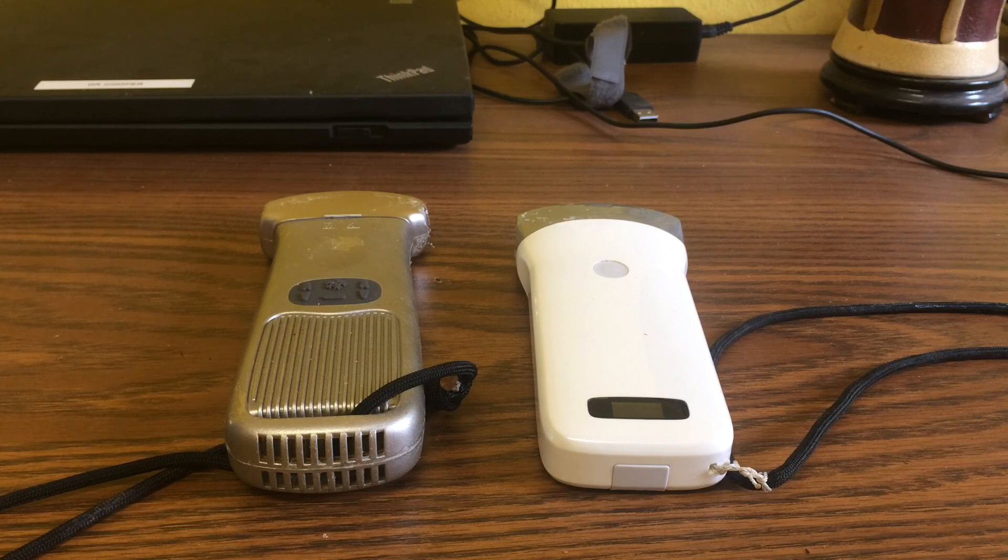As it turns out, you can buy some pretty inexpensive ultrasound units on eBay. I can't vouch for them all, but I have bought two units from two Chinese companies and I have been pleasantly surprised. I bought these two wireless probes, which can be used with Android, iOS, or Windows.